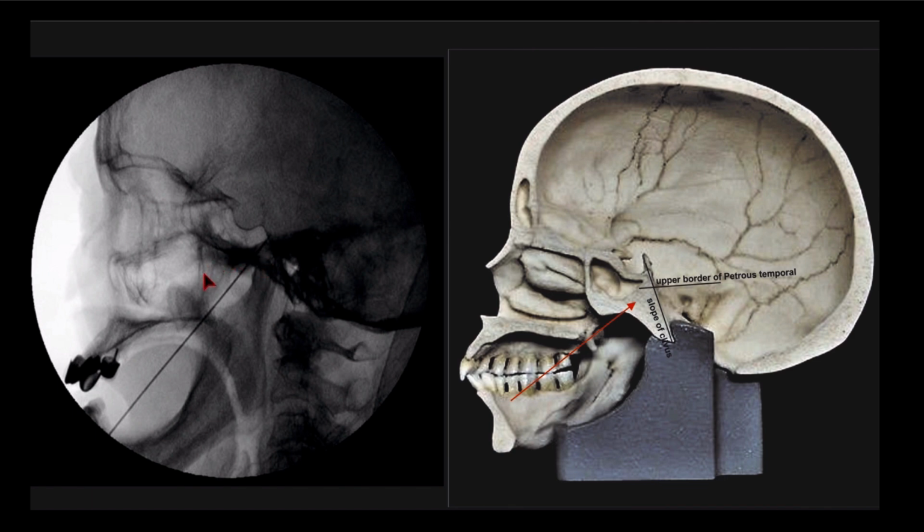In the lateral view, for other procedures like the sphenopalatine ganglion block, you can find out here. We can see this teardrop. So that is the pterygopalatine fissure or pterygomaxillary fissure. This is the pterygoid plate. This is the posterior surface of the maxilla. This is the mandibular notch, condylar process, coronoid process.